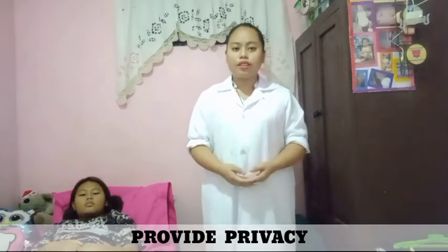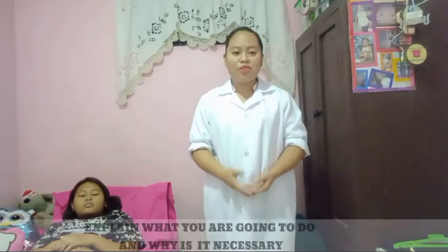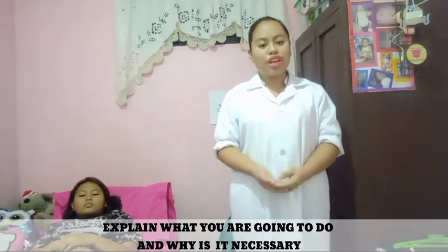Close the curtains around the bed or close the door to the room. This is to provide privacy. Explain what you are going to do and the reason for doing it to the patient. Review safety precautions necessary when oxygen is in use. Place no smoking sign in appropriate areas.